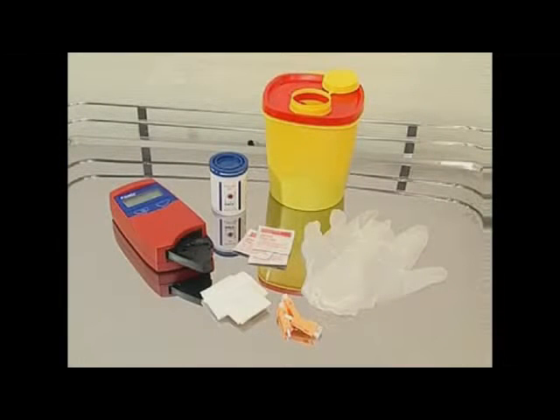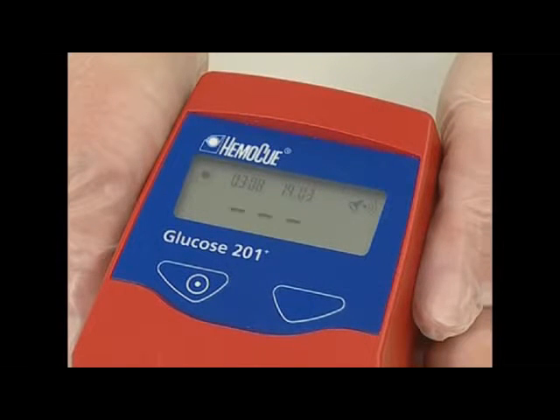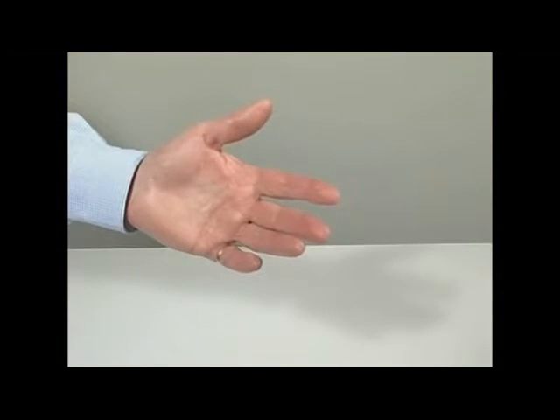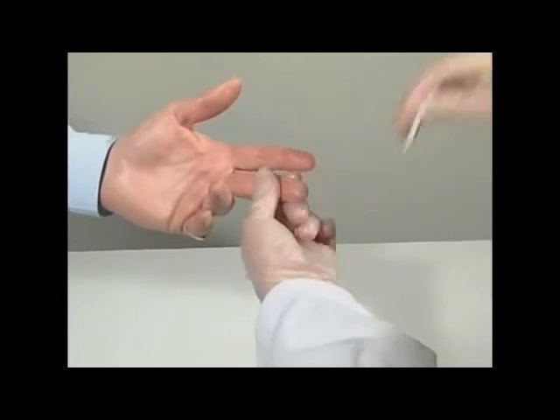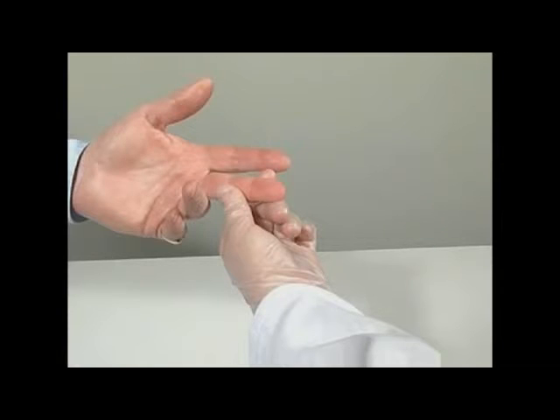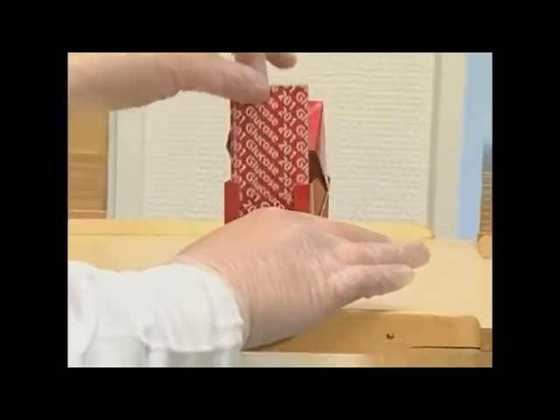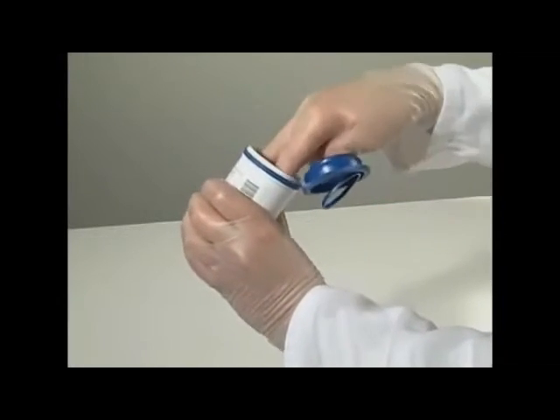Make sure that all the supplies are to hand. After startup, the cuvette holder should be in its loading position and the display will show three flashing dashes and the HemaQ symbol. Make sure the patient's hand is warm and relaxed. Clean with disinfectant and allow to dry. Use only the middle or ring finger for sampling, and avoid fingers with rings on them. Take the micro cuvette out of the package; if a vial is being used, close the lid immediately.